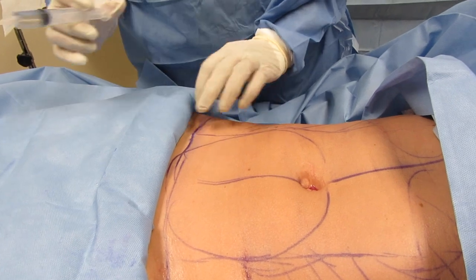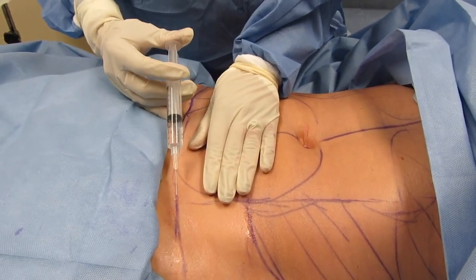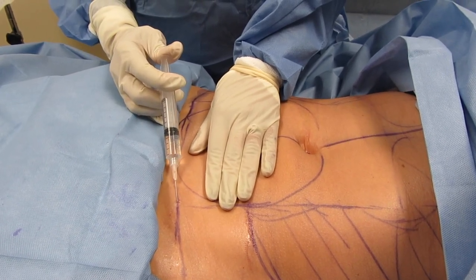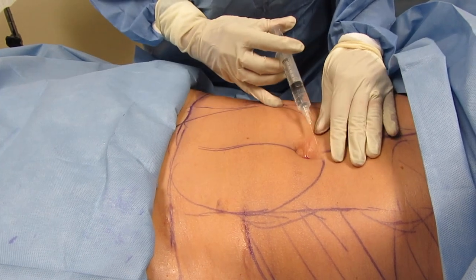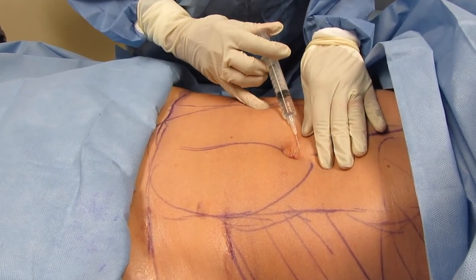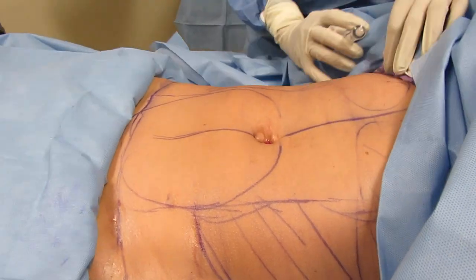Just making little blebs of lidocaine to numb before she... How is that? Okay. Fine. There you go. These are the spots where the incision would go. Tiny pinch. You're doing awesome. Right.